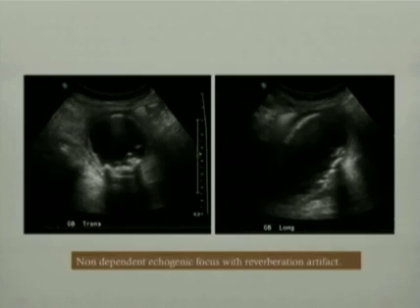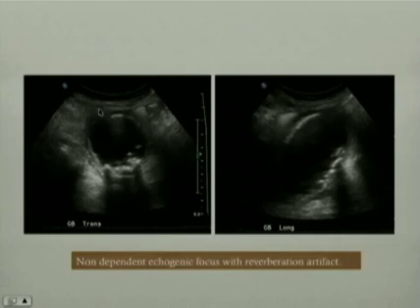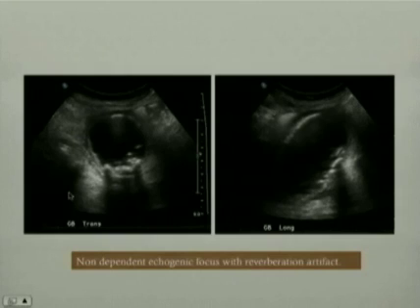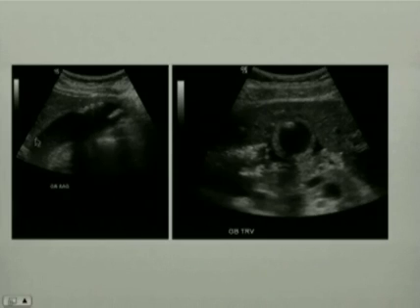Yet another, better example of ultrasound images of emphysematous cholecystitis demonstrates a very inflamed gallbladder. The transverse and sagittal images demonstrate a distended gallbladder, some dependent echogenic foci with posterior acoustic shadowing representing gallstones, and some non-dependent echogenic foci more anteriorly with posterior reverberation artifact suggesting the presence of air. Another example shows a distended inflamed gallbladder with dependent echogenic foci representing gallstones and non-dependent echogenic foci demonstrating air.